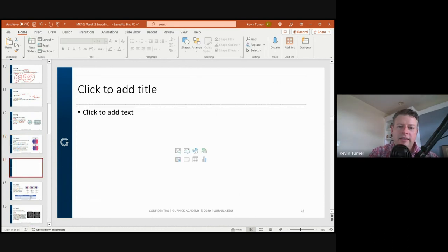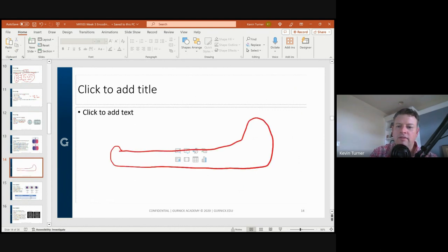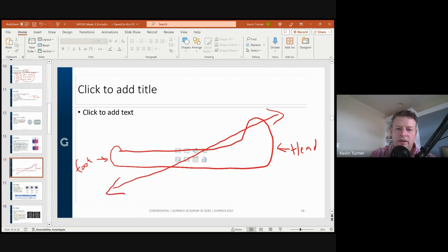So we think about it like this. Here's our patient. My horrible drawing of a patient. There's the head. There's the foot. Not even feet, I'm just going foot. When we turn on a gradient, this is our isocenter. We alter precessional frequency. Now, these protons are going faster and these protons are going slower because this is the positive end of the magnet and this is the negative.